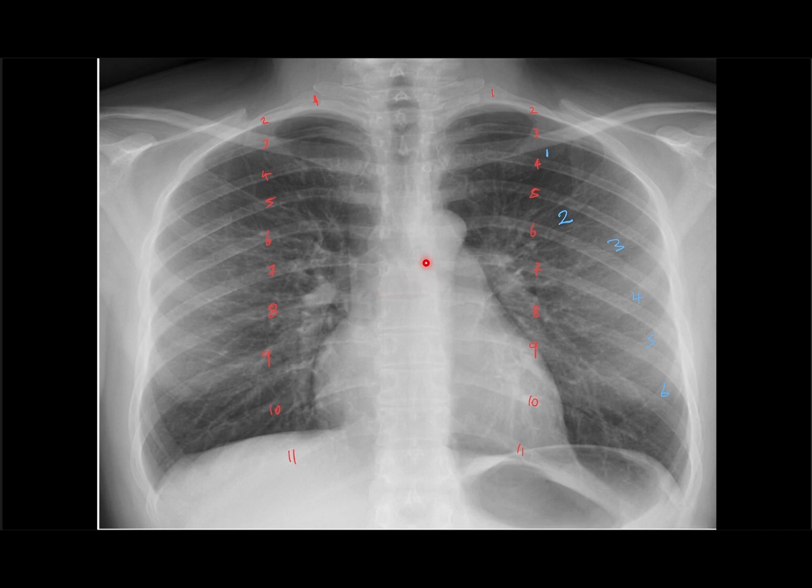These are the thoracic vertebrae. These are the spinous processes of the thoracic vertebrae. These are the lung zones. The lung zones contain air, and air is radiolucent. That is why it appears dark. This is also the lung zone on the left part.